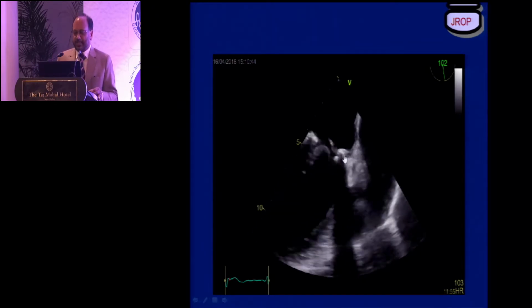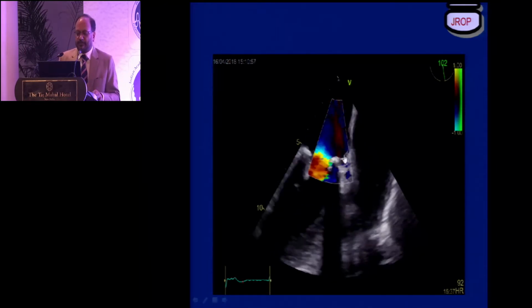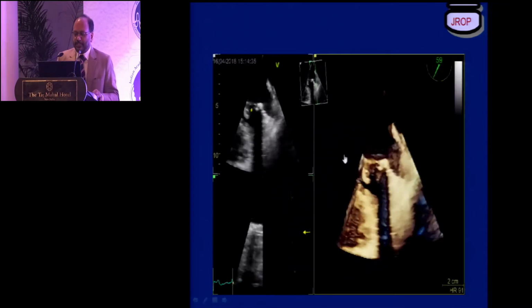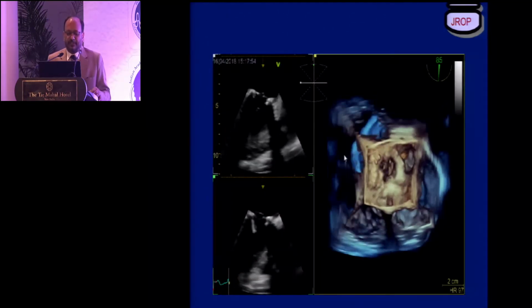Obviously, we have to scratch our mind. At that particular point, the patient had no past records of his imaging, no past records of his surgery, and no follow-up echo was seen. So we went on to do a 3-dimensional transesophageal echo.